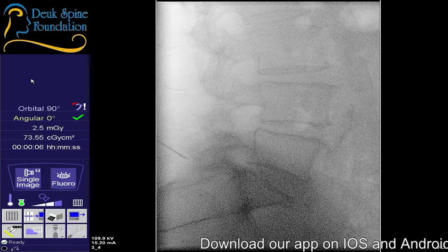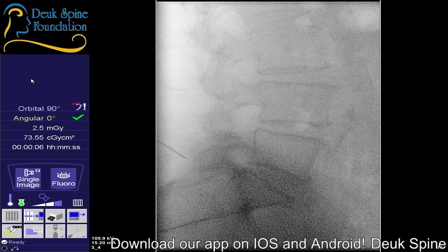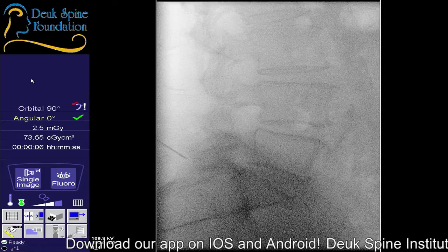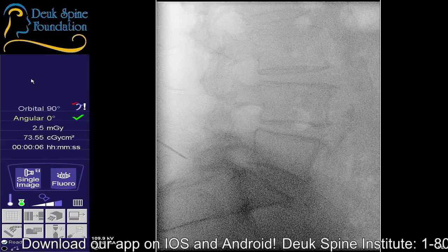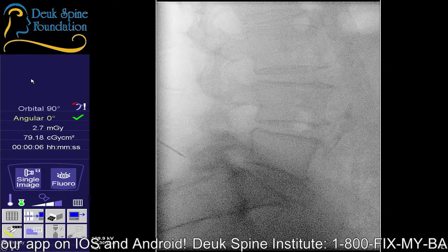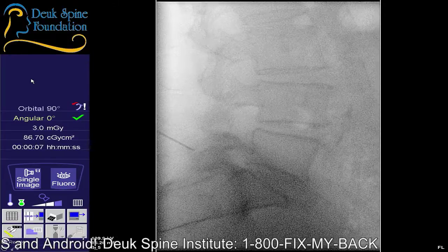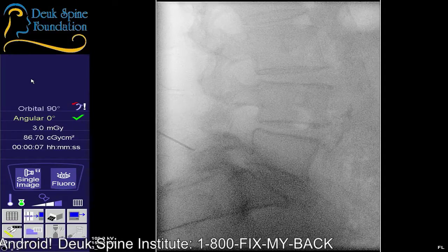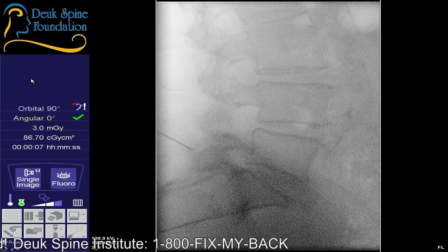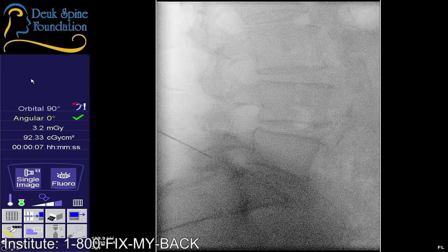So right now I'm trying to access the disc at L5S1. Our patient, as always, is awake. She's awake for the very beginning. Are you comfortable? You doing okay now? She said yes.